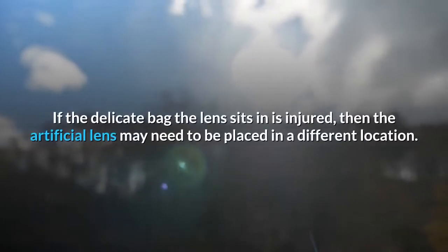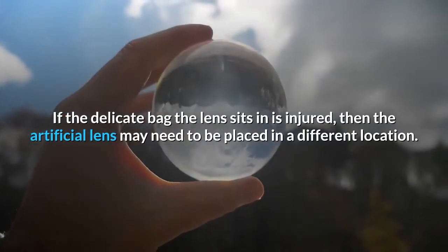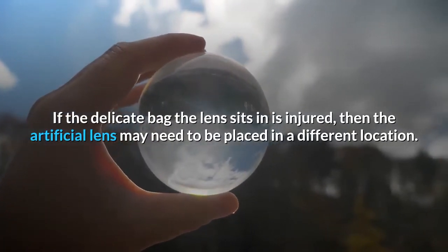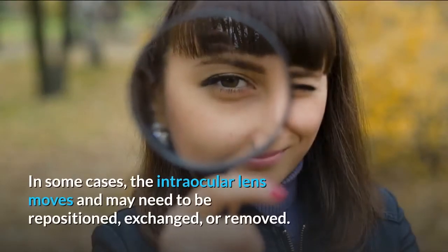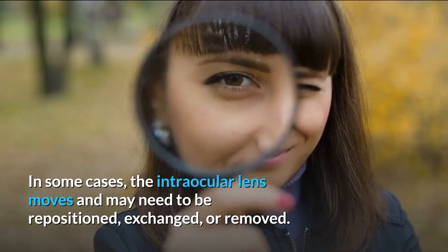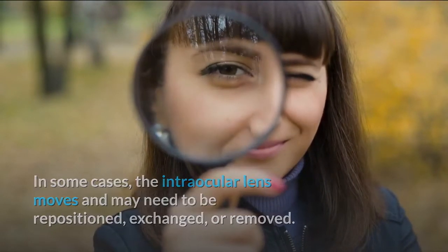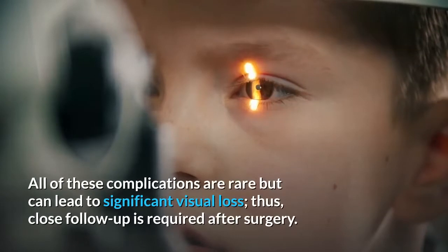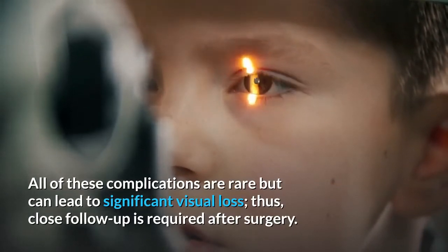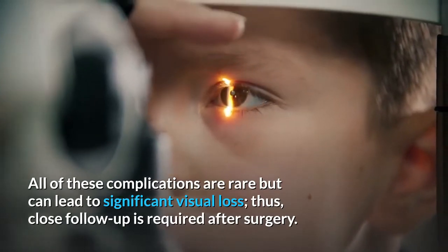If the delicate bag the lens sits in is injured, then the artificial lens may need to be placed in a different location. In some cases, the intraocular lens moves and may need to be repositioned, exchanged, or removed. All of these complications are rare but can lead to significant visual loss; thus, close follow-up is required after surgery.